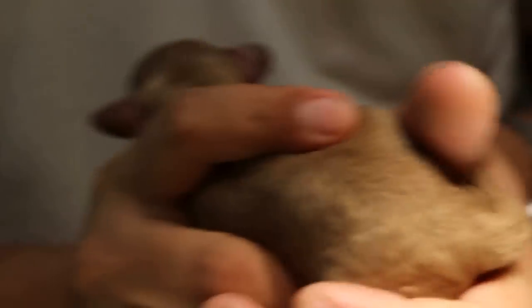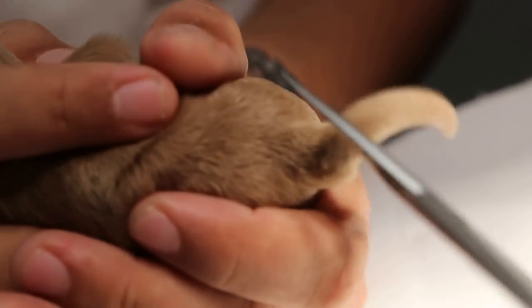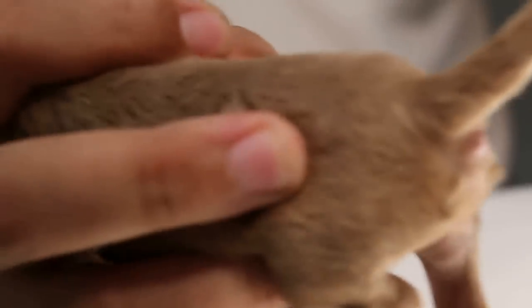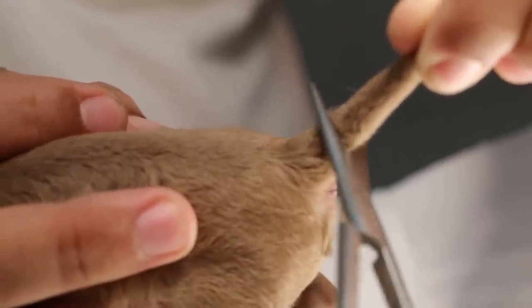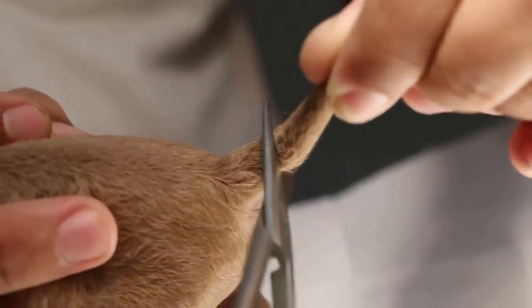I'm going to demonstrate this now on this puppy. The assistant holds the puppy facing left. I'm not cutting — just showing. The scissors are angled at 45 degrees, and from the top you turn the skin forward, towards the anus.